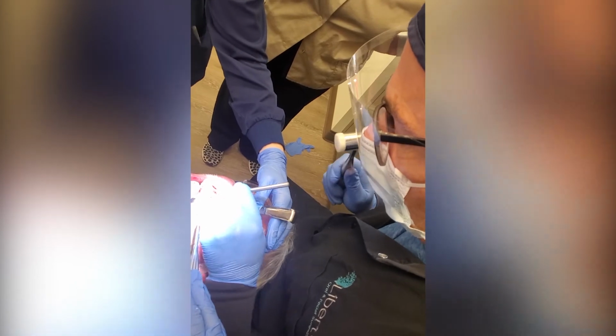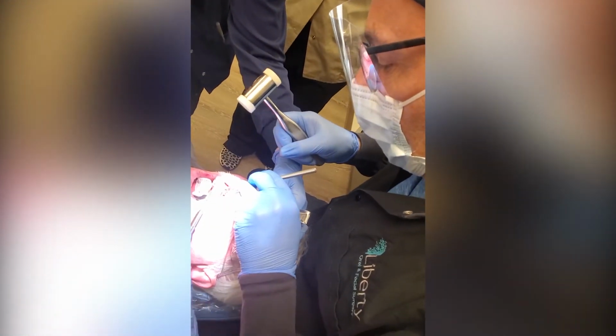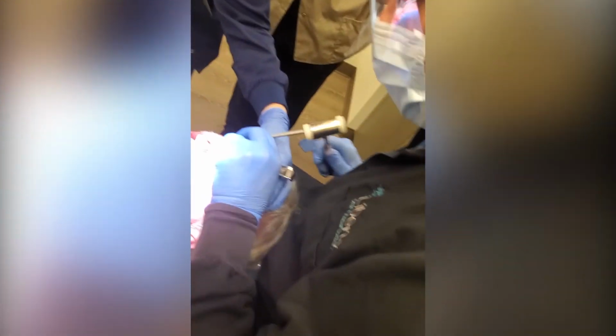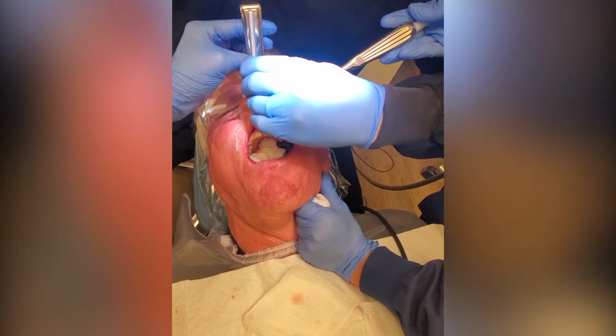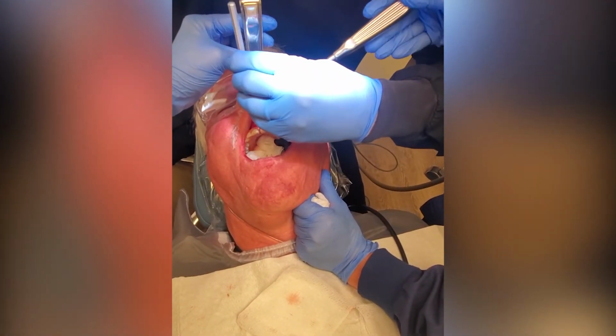So you just make a little groove and then you cover it with that? Use this to complete it. The tricky part is that this part's pretty much blind. That bone's really thick back there.